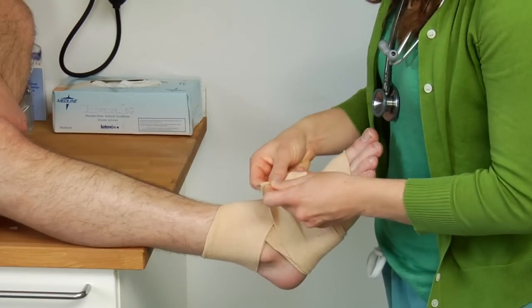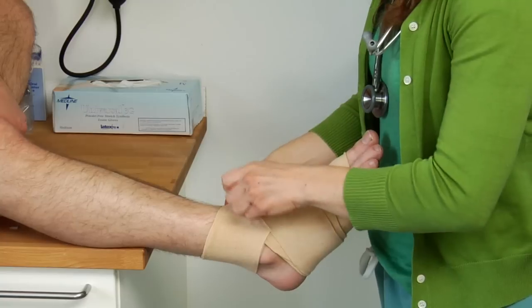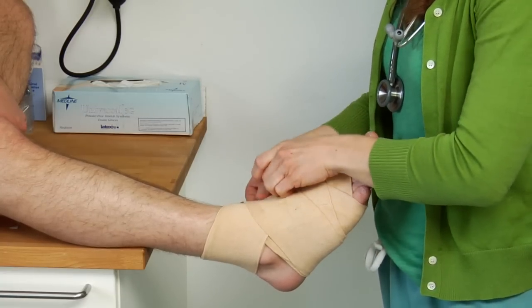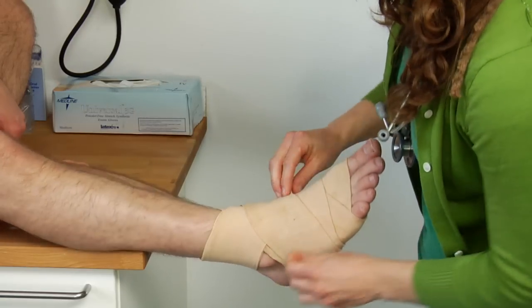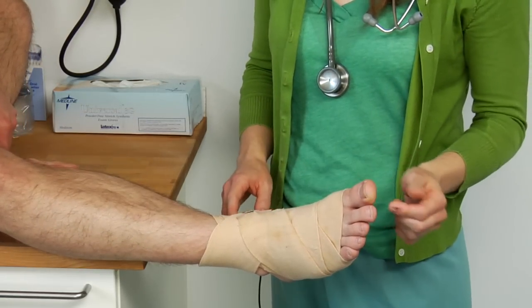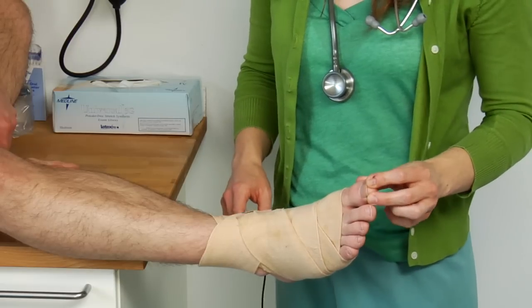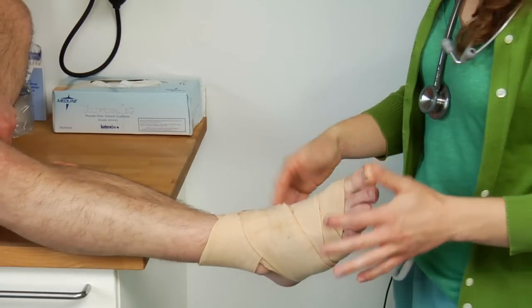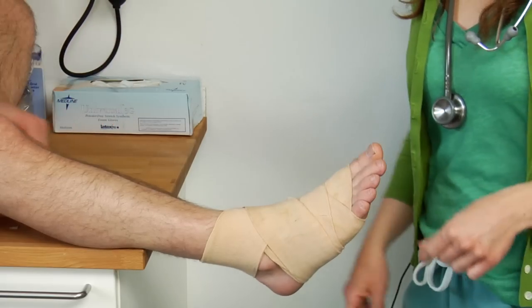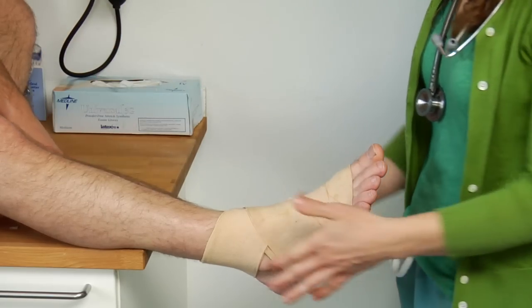Some of these have little metal clasps or they actually fit with Velcro nowadays. You'll just tighten that off and you want to make sure they still have good blood flow and cap refill to their toes. Ask them, "Do you feel support in the right area? Do you have any numbness or tingling?" And that's one of the best ways to use an ACE wrap for supporting your ankle if there's some sort of an injury.